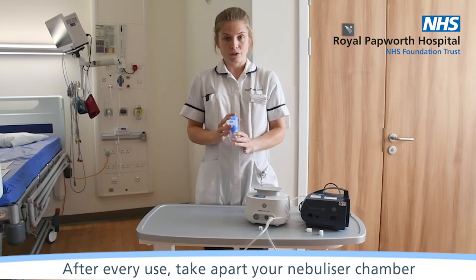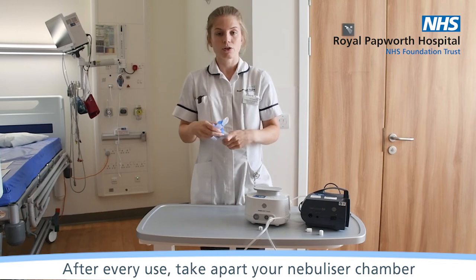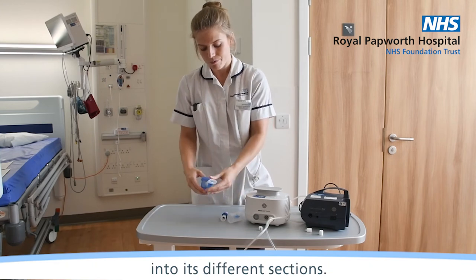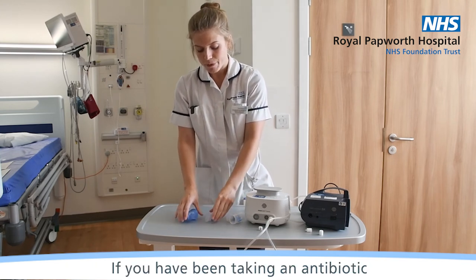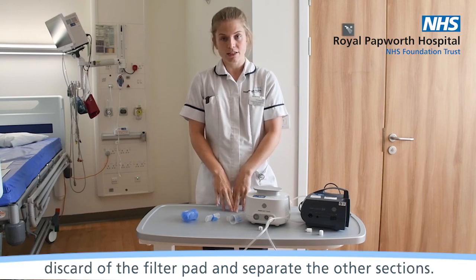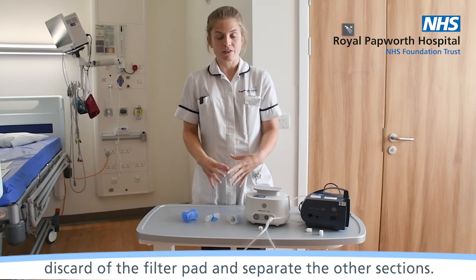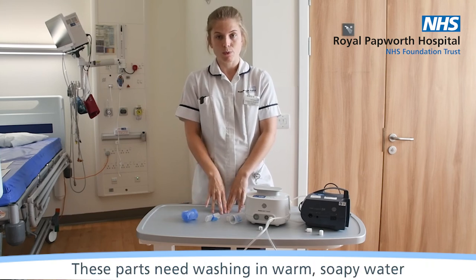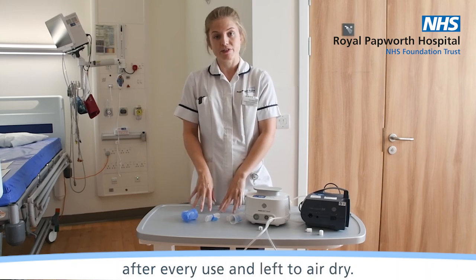After every use, take apart your nebuliser chambers into its different sections. If you've been taking an antibiotic, discard the filter pad and then separate the other sections. These parts need washing in warm, soapy water after every use and leaving to air dry.